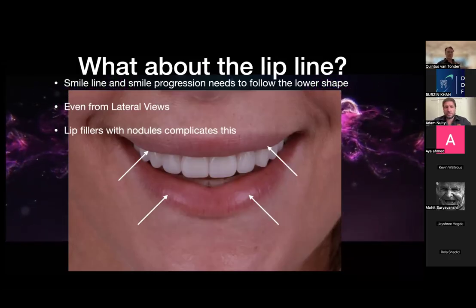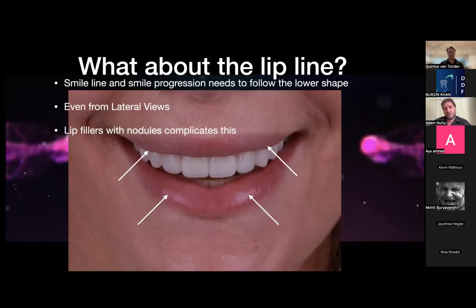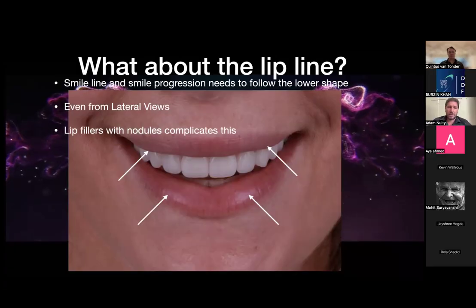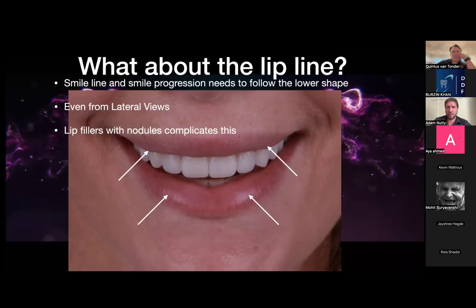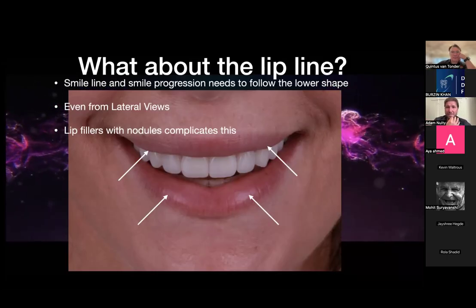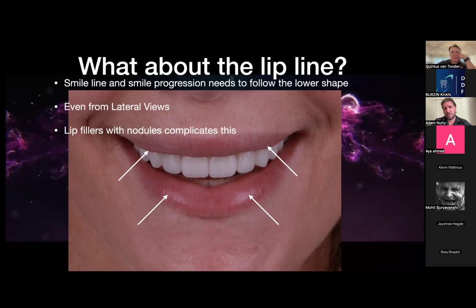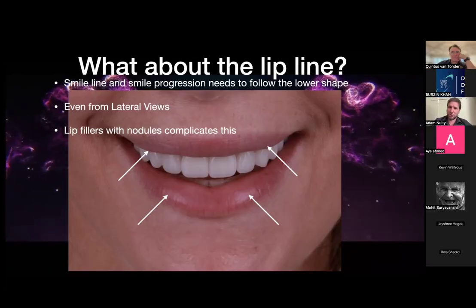I think it's easy, if you don't mind me interjecting here, Quintus, you can see from this picture how much I always find, no matter what you do in terms of making teeth look natural, and this is, I think, why this sort of look, they go for, I know the colloquial term turkey teeth, but more, tic-tac teeth, big, bright, white, straight teeth. They like that because when you've got more natural teeth, they look wider when the lips change shape.